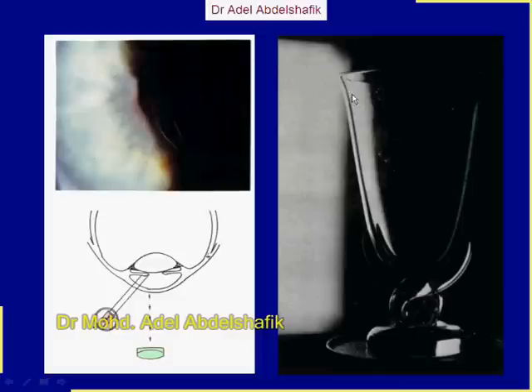Again, we can see here edge of these glasses, and also you can see this against darkness. Here you can see these lines. What does it mean? One of the tricks we have to do all the time while you are doing the slit lamp, you can unlock the screw that fixes the light under microscope, put the light a little bit to the side, and try to learn to see not only against the illuminated area, but next to the illuminated area.